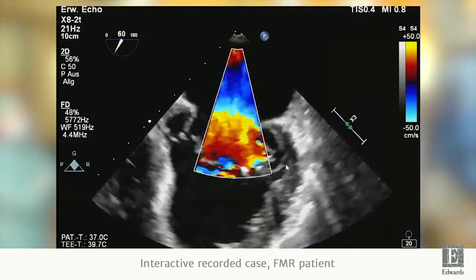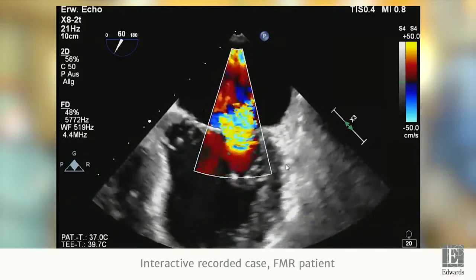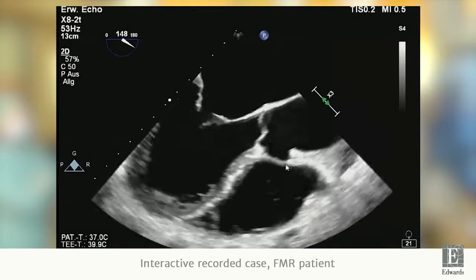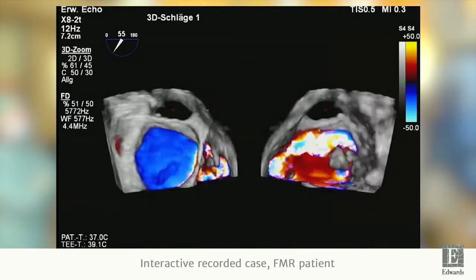What's important to mention here is that the overall mitral valve opening area was just a bit more than 4 square centimeters. So this is important when we decide on a strategy whether we should go for 1 or 2 devices with that size valve. You would normally think that that valve could only accommodate 1 device. So we were still about to come up with a strategy.